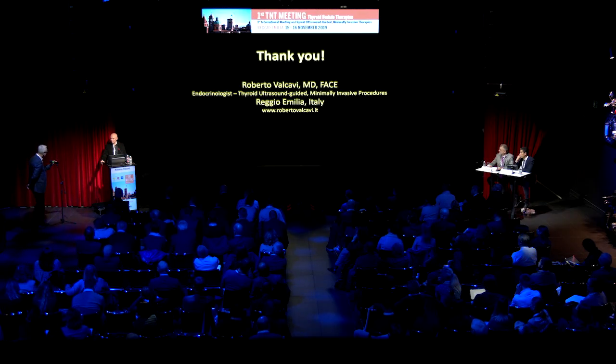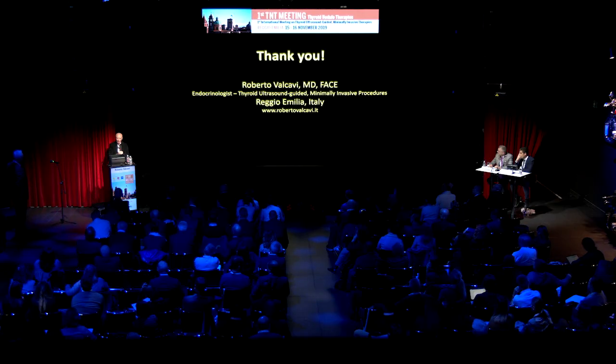Thank you. Another question. Sometimes we see that immediately after evacuation of fluid, the cyst refills with blood. Immediately. What to do? You should be careful to avoid forming a vacuum hemorrhage. It happens.